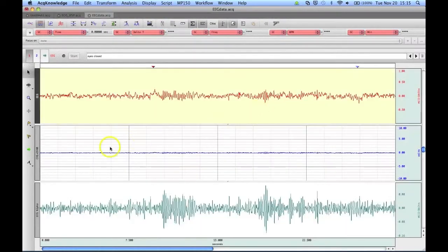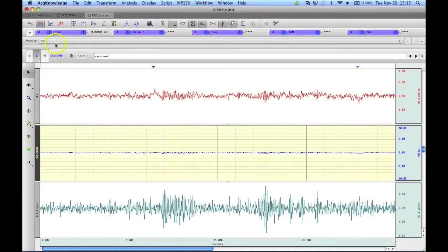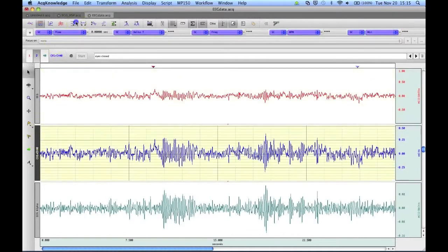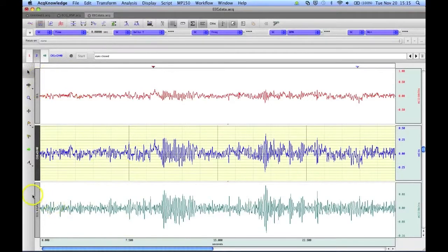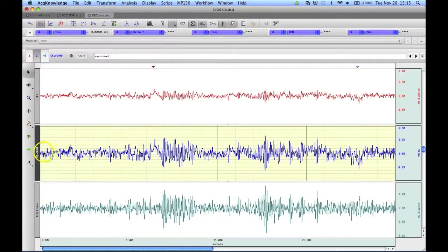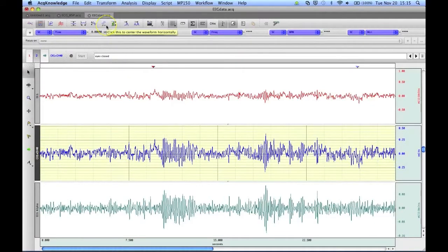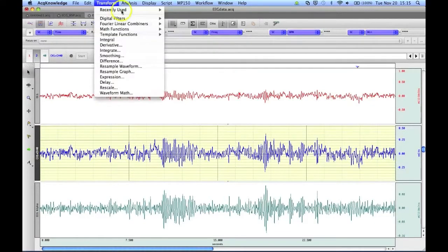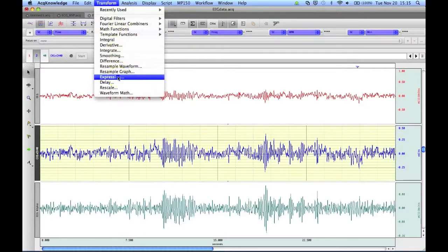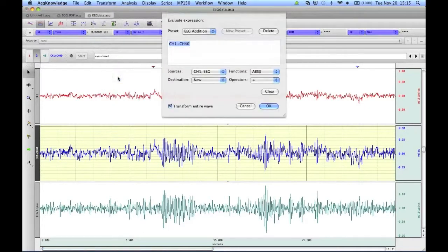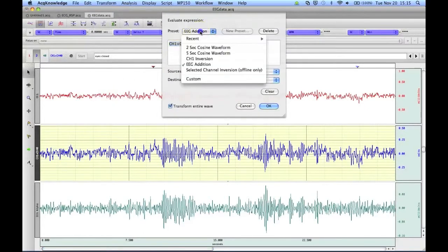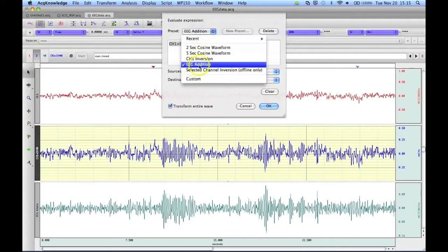And now you'll see here we have our result of the first channel plus this channel pasted in as a new channel. If we were to want to do that transformation again, we could go back to the Expression, and you'll see we have the EEG edition listed now as a preset on our Expression Generator.